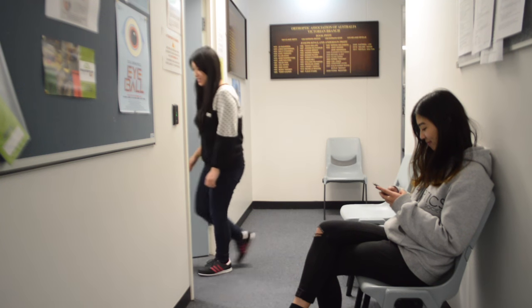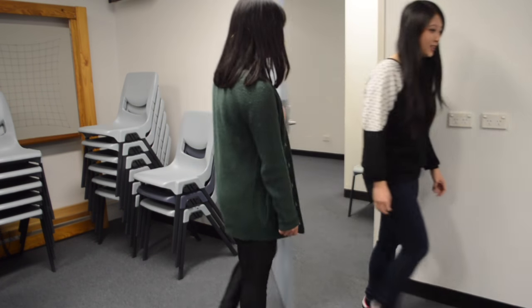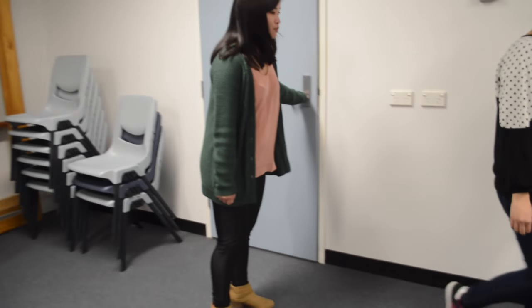Hi, how are you? Do you want to have a seat? So my name is Sam. I'll be your practitioner for today. I'm just going to be performing some baseline examinations on you to determine the size of your deviation.